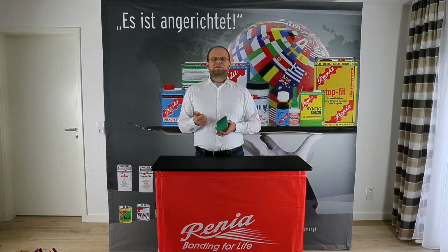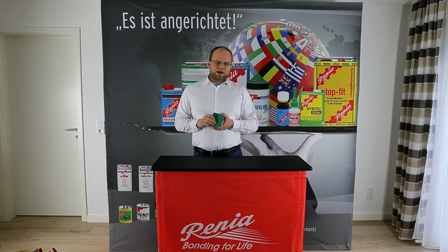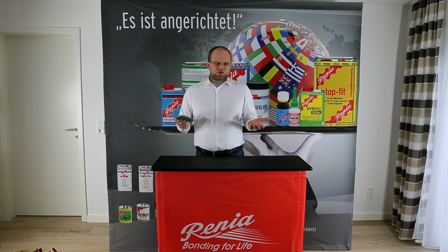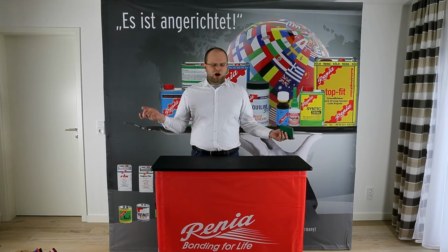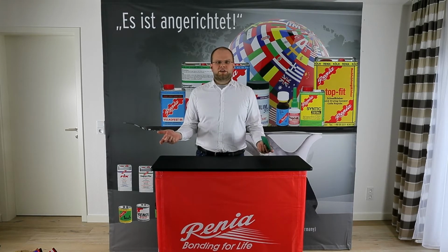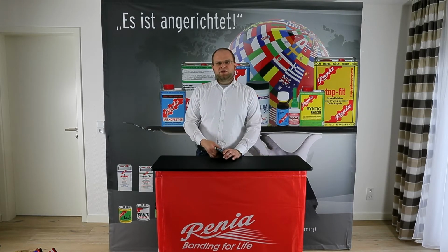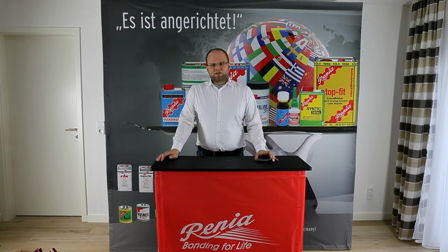So open cell foam and a skin around the outside. Most materials you can buy already have that skin removed or abraded on one side, in some cases on both sides. So it is a lot easier to bond because it's also usually fresh material, not worn material. You'd usually take this out of the box, and that also makes identification easy because it says PU on the box. There's several brand names that people usually look at when they're dealing with this.